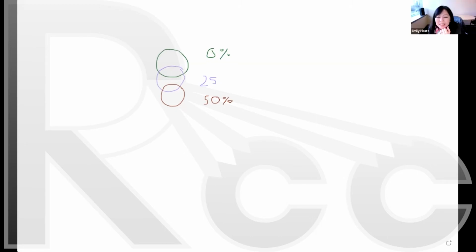Okay, so the maximum intensity projection would look something like this, where the whole thing is filled. Everything in here is filled with tumor, because we have the tumor here, that's what's summing up here. We have the tumor here, and that fills in the middle. We have the tumor here, and that fills in here. So it's the Boolean sum of all of these structures together. So that whole thing is filled with tumor. Okay, that's the maximum intensity.